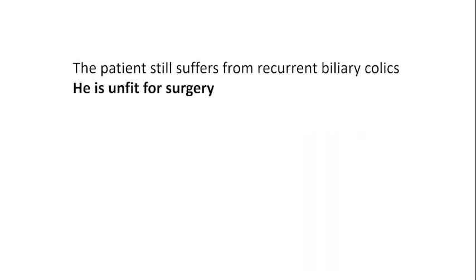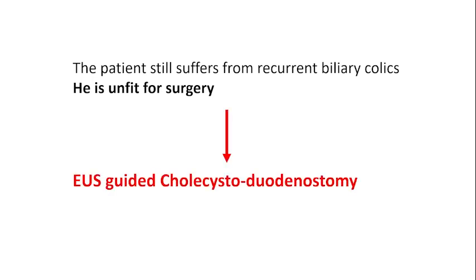So the patient still suffers from recurrent biliary colics, and he is unfit for surgery. So the best decision for him is to do EUS-guided cholecystoduodenostomy, which will be done by Dr. Marc Barté.